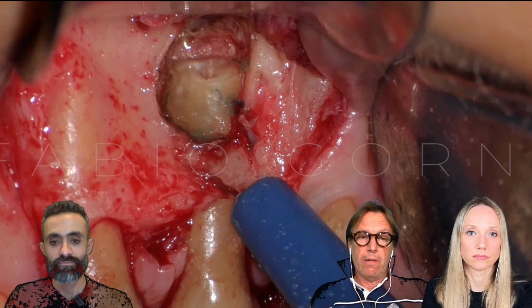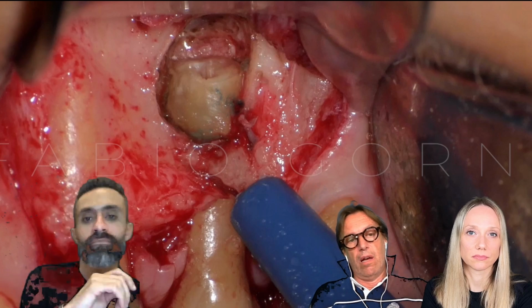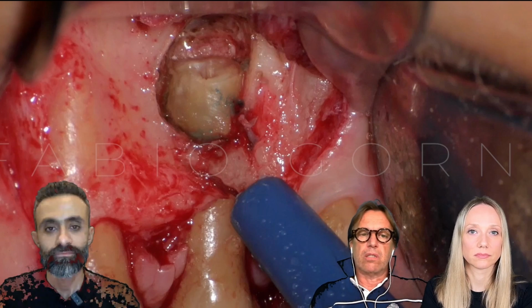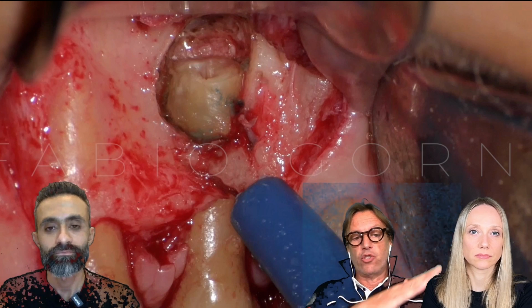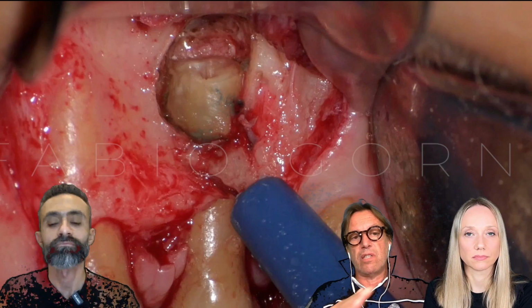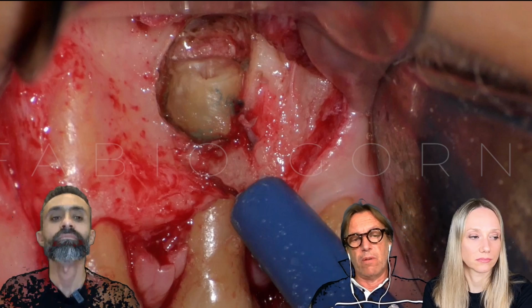Sometimes the bevel also completely changes our possibility to save part of the root. For example, when the lesion is completely mesial or distal, we can change the bevel following the lesion and save sound bone in the other part of the osteotomy.